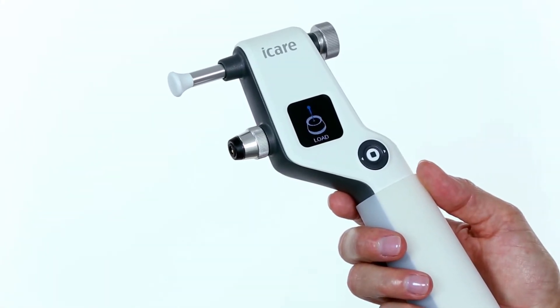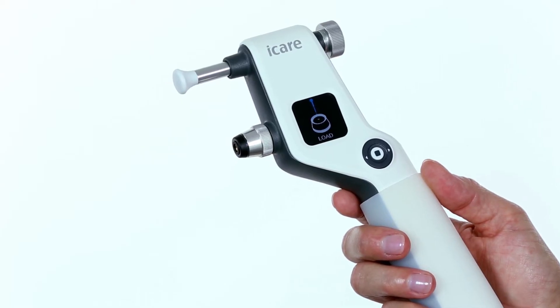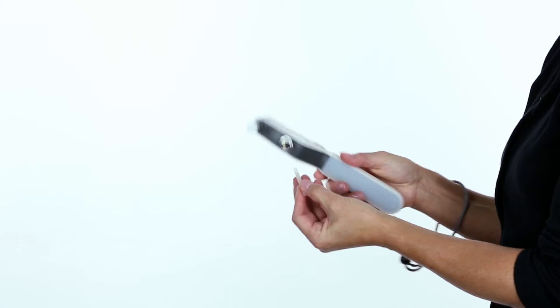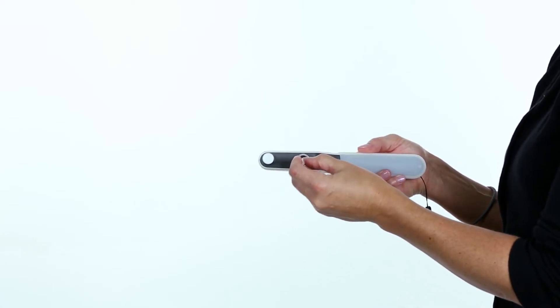Load the probe into the tonometer when the display screen shows Load Probe. Open the probe tube by removing the cap and insert the single-use probe into the probe base.